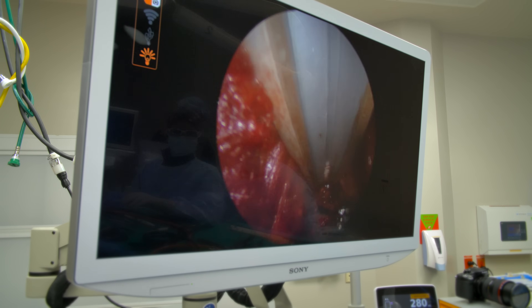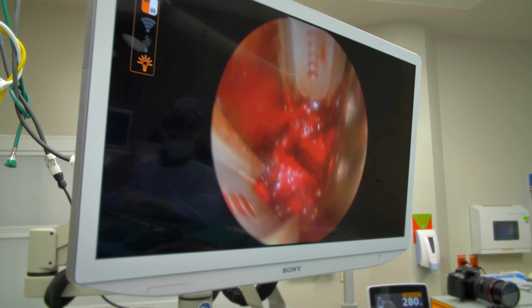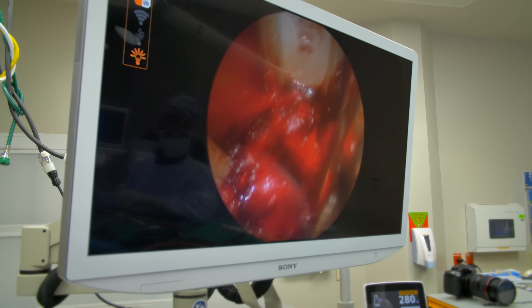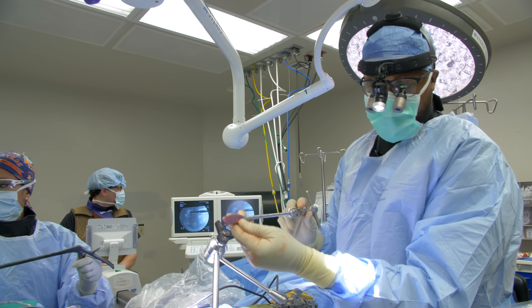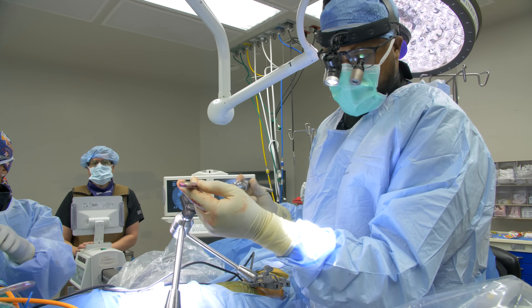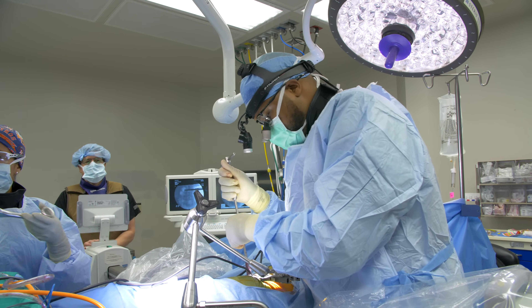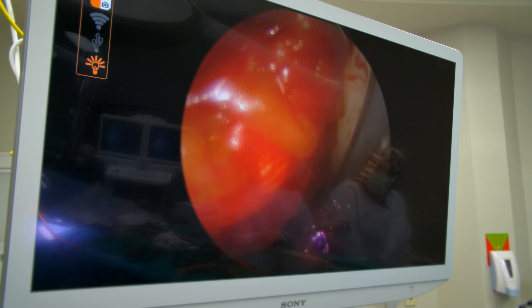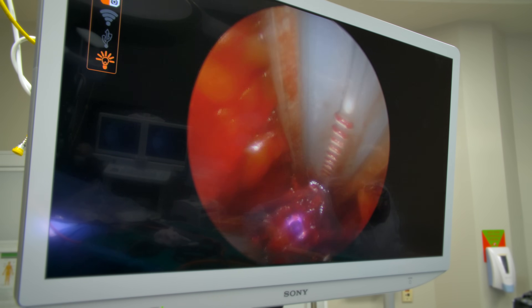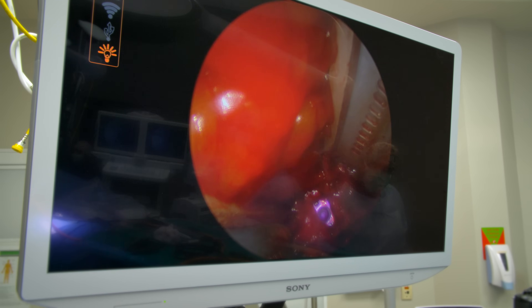We've completed the discectomy. That little hole is where the cage is going to go, right between L3 and L4. This is the trial — the little purple device — sitting between those bones. We're going to take an x-ray to see what the positioning looks like.